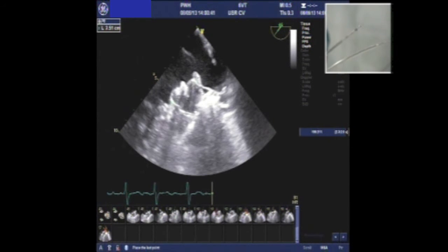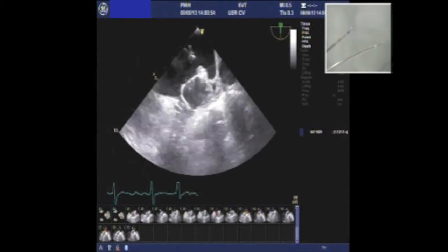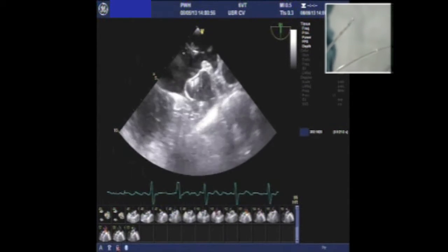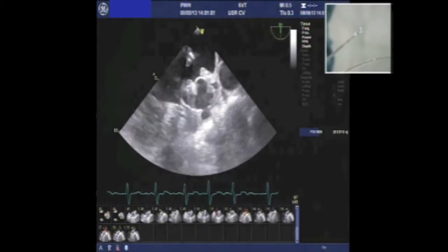So it's 25 millimeters. It looks good, right? Okay, so now let's look at the demo, and then we are finished with this case. Can you put the live screen large, please?